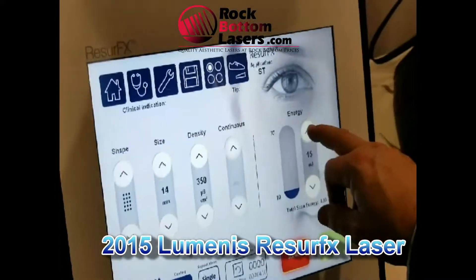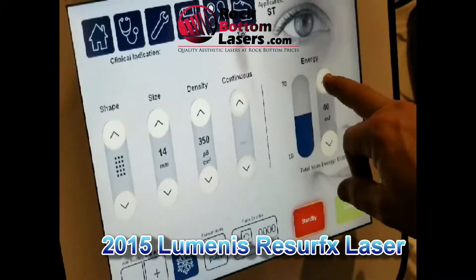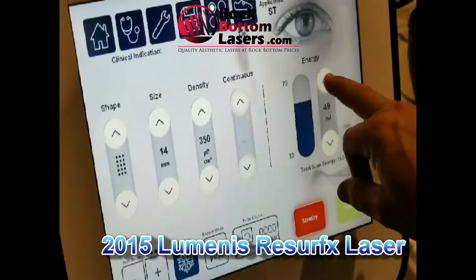And here's our power. Let's turn the power up here and make sure it goes all the way up. Looks good.